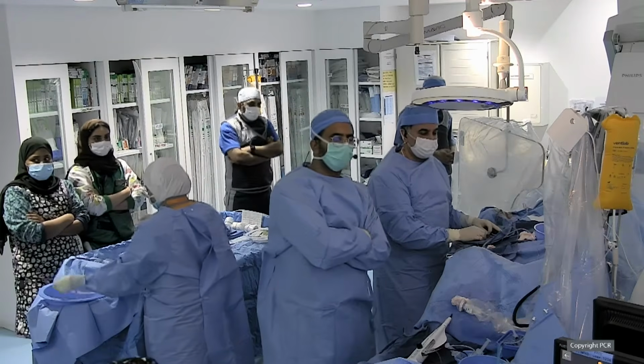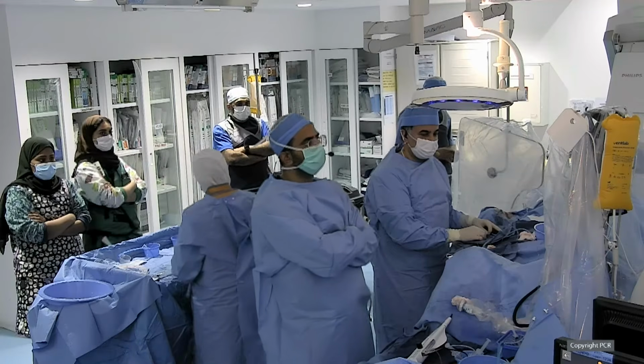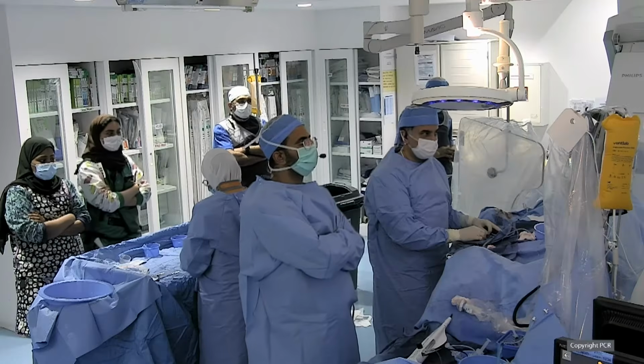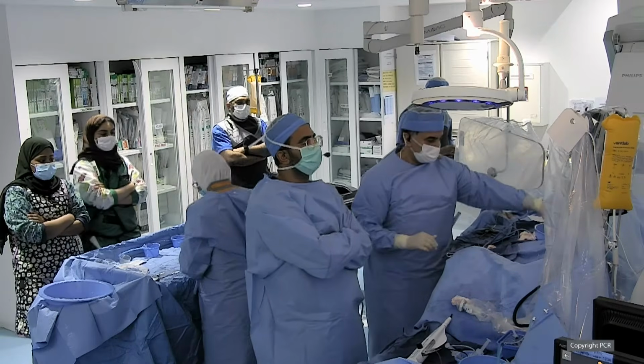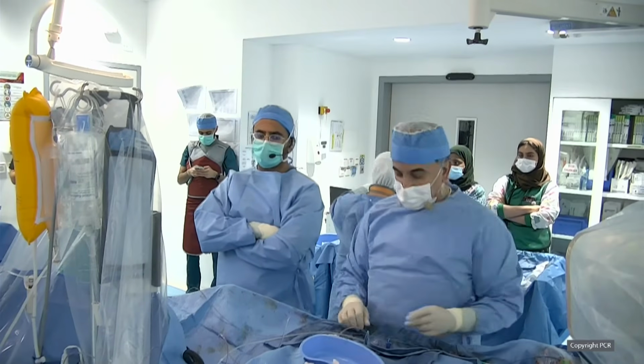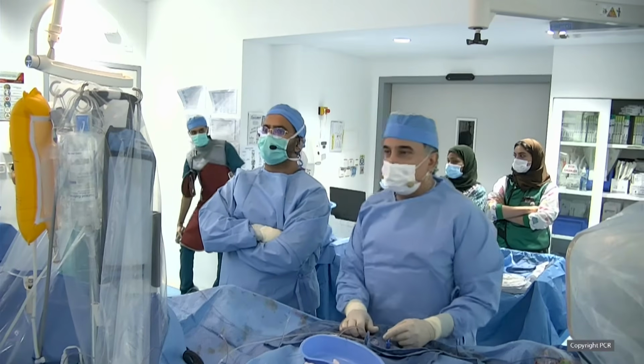We just had the patient presentation, and now we're keen to learn from you what your procedure will be. Thank you for the presentation, and thank you for inviting us. We already dilated his RCA, and we stented that with 2 stents.